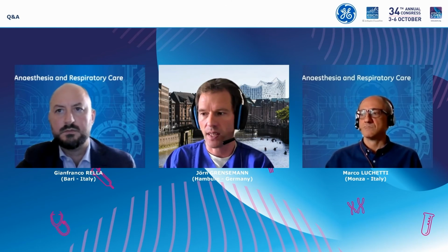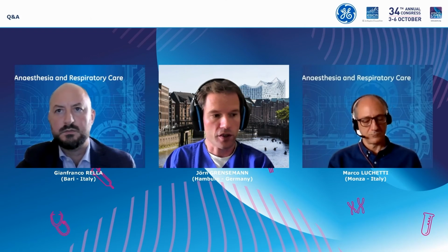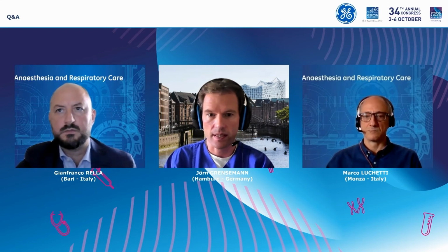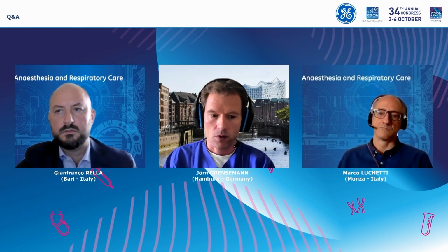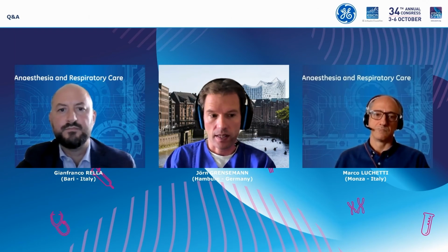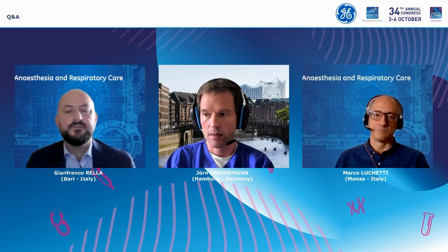And after that, usually the nutritional requirements remain stable, except the patient suffers a second hit, maybe another sepsis or something else. So you have to look at your patient and see if he's currently stable or not. If he suffers a second hit, then we would reduce nutrition again and take measurements immediately.